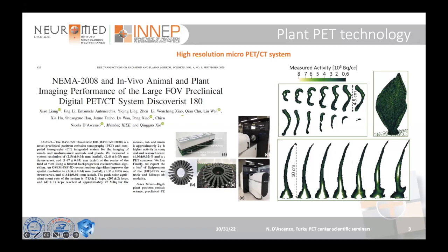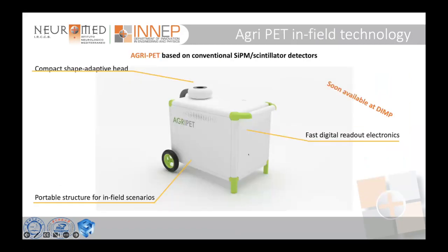The scanner is very specific because it's me and my group who built it. Soon you will have available at our node the AgriPet. It's a portable PET system that we also developed, very compact, shape adaptive, portable, also for in-field scenarios.